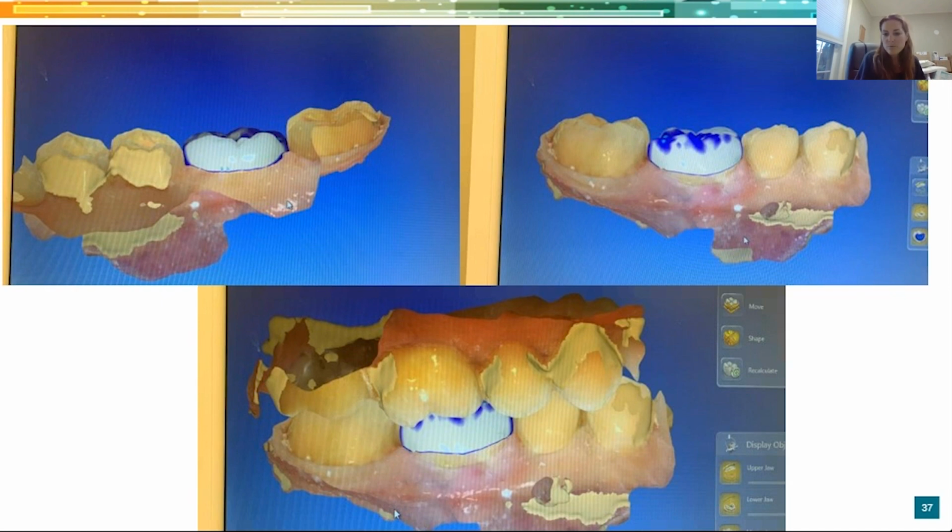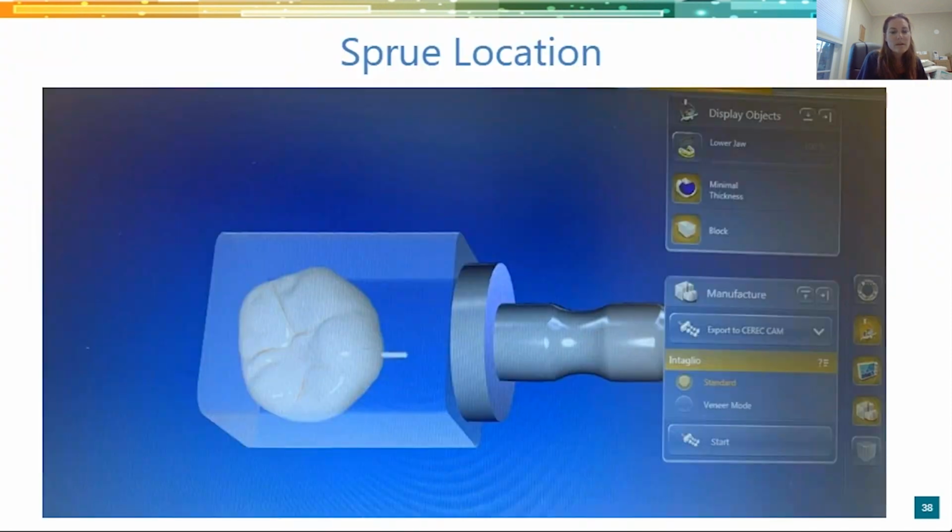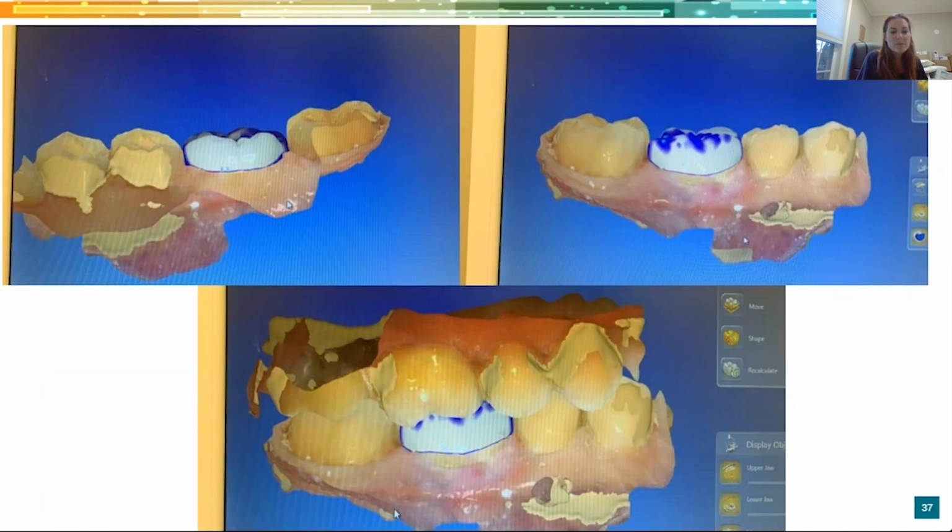Again, that's total personal preference. You want more morphology or less, it is completely up to you. You're in control. You can see that the margins are all supragingival too. It's a little tight here, but I do have about a half a millimeter on the lingual and about a millimeter or two on the buccal.